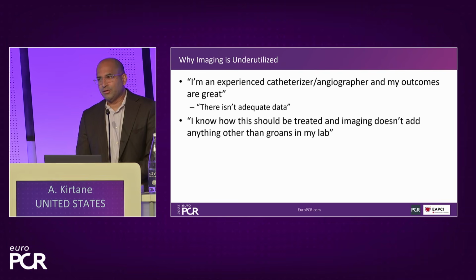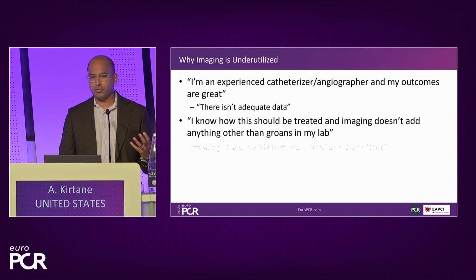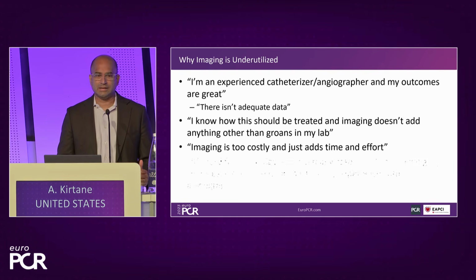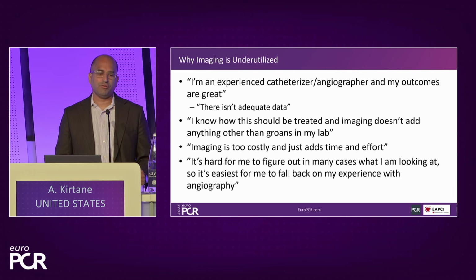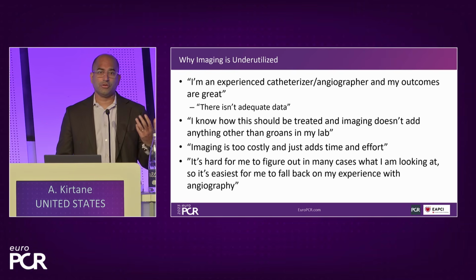Okay, if you accept the fact that there's data, that's okay, but it's expensive, and I know how this should be treated. Imaging doesn't add anything other than make my staff groan about doing it. It's too costly, adds time and effort, and it's hard for me to figure out in many cases what I'm looking at. So it's easiest for me to fall back on my experience with angiography. I think this last part is where we're getting closer to the truth.